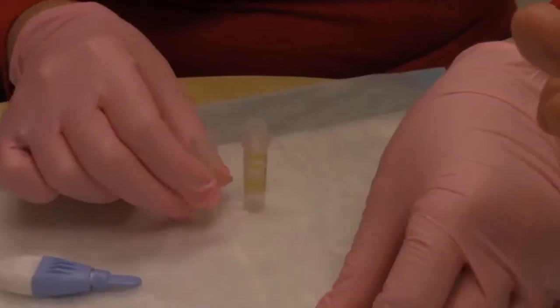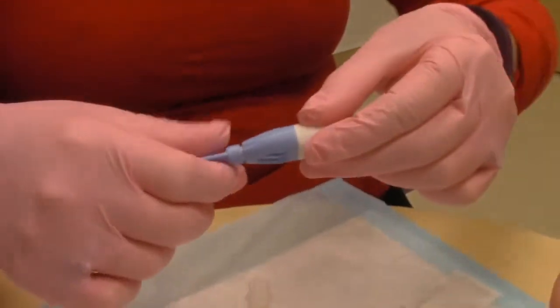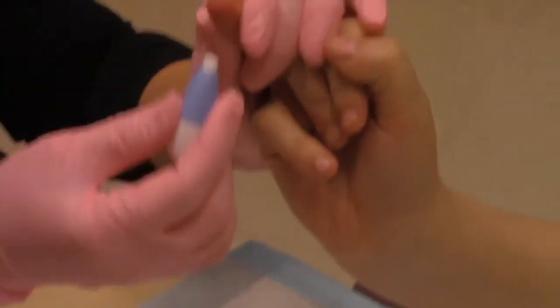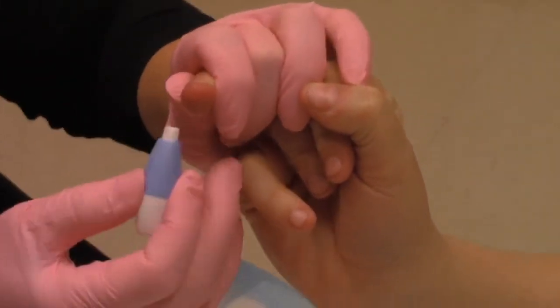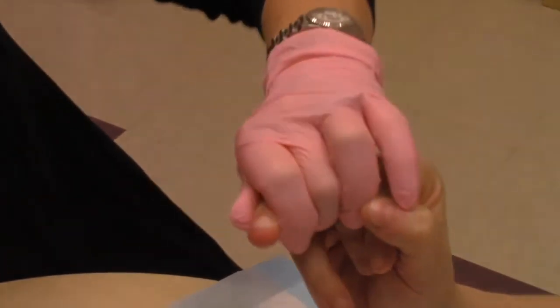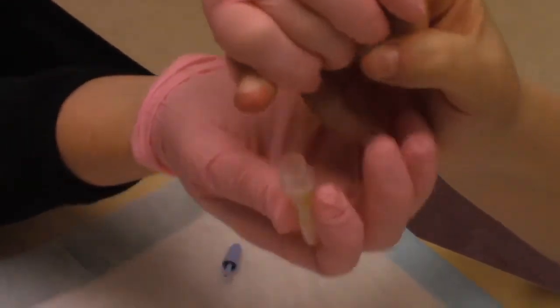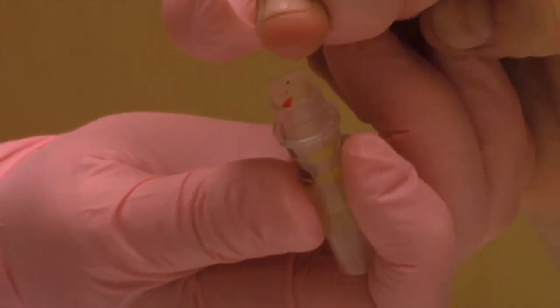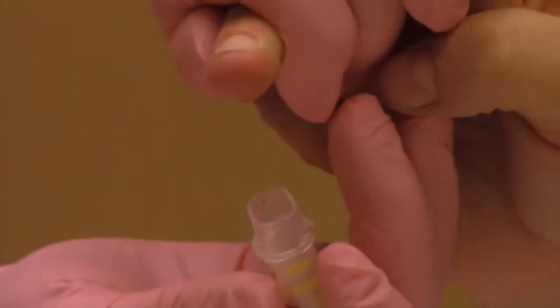Uncap the tubes and place them close by. Pull the cap off the lancet and press the lancet against the outside of the fingertip like so. The lancet is pressure activated so once you have pressed the poker against the finger hard enough, the lancet will be released for the poke. You will hear a click once it has been activated.